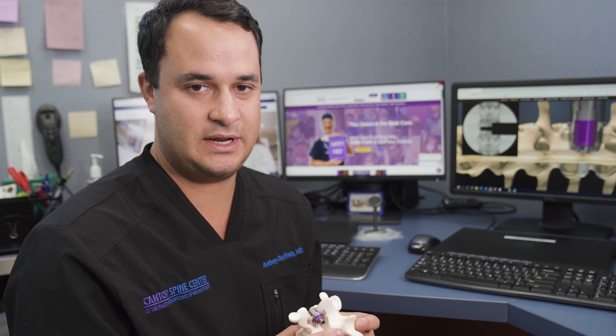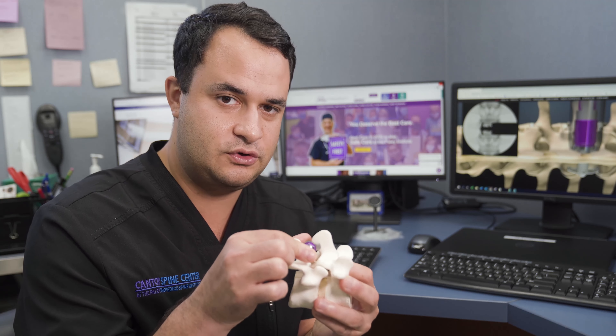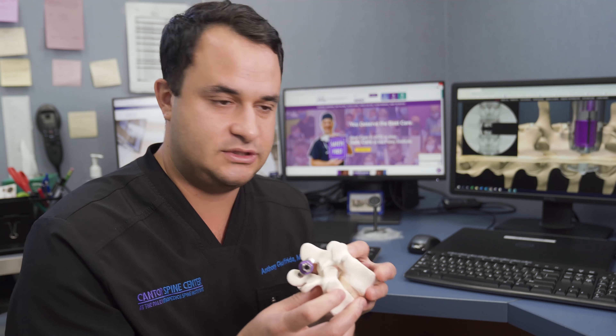Hey guys, Dr. Jafrida here again, and today I want to talk about a brand new procedure called the Minutemen procedure by Spinal Simplicity. What this is is a posterior fusion device in order to stabilize a joint.